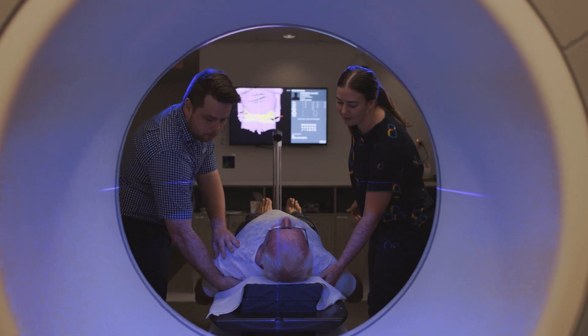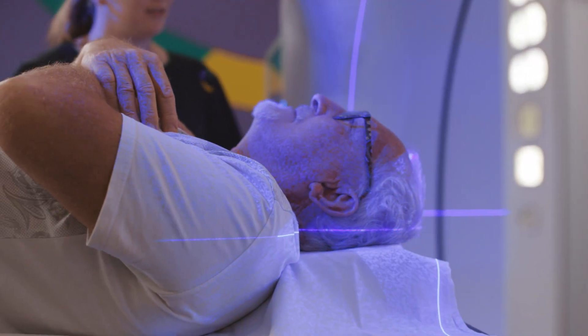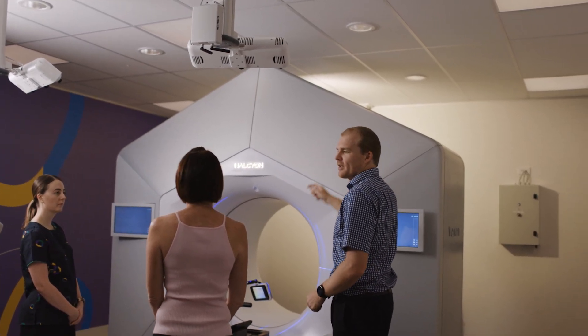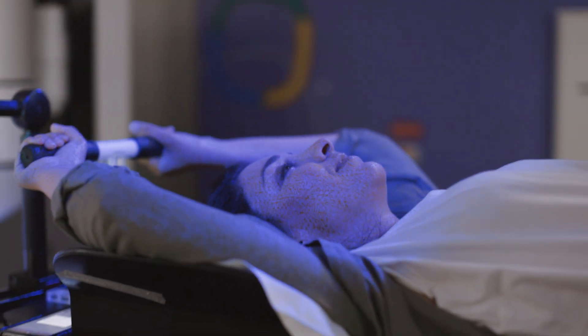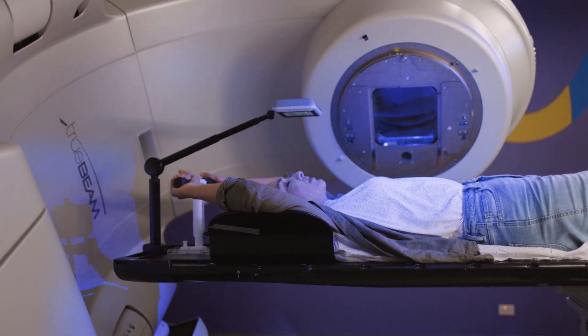Variant Identify is an innovative tool that allows us to deliver radiation therapy in an accurate and efficient way. It uses an integrated camera system that monitors the patient contours during treatment. Those cameras project a map over the surface of our patient's skin in the area that we're interested in or targeting.